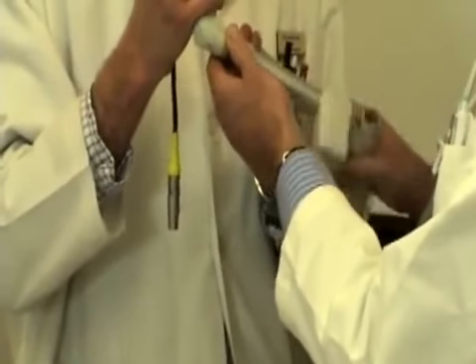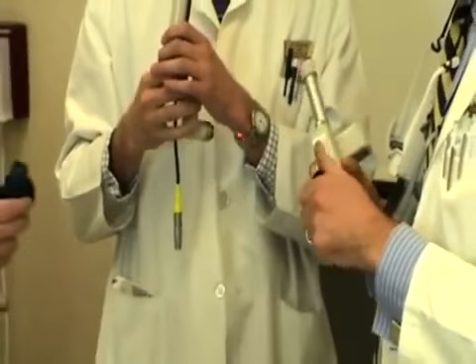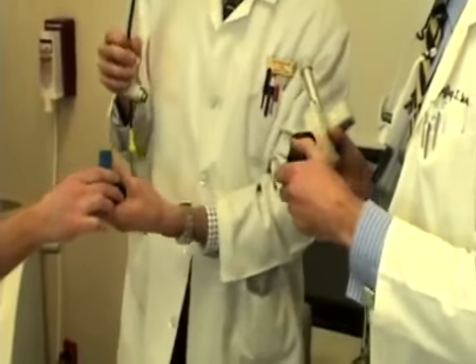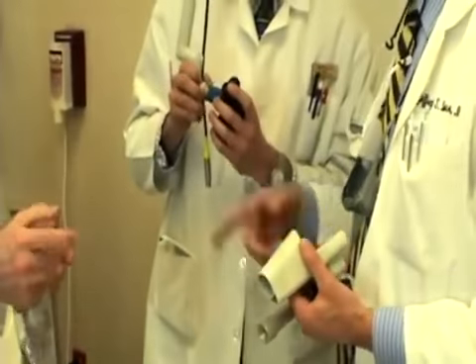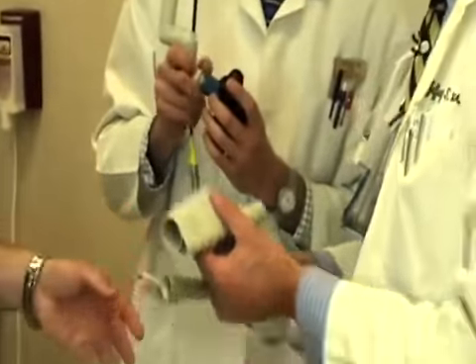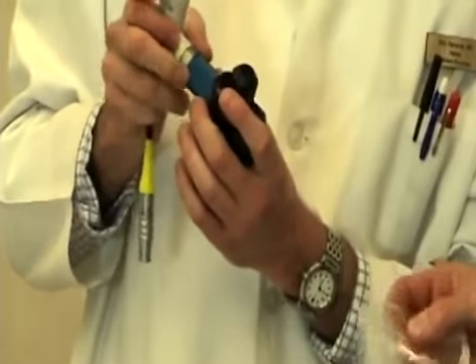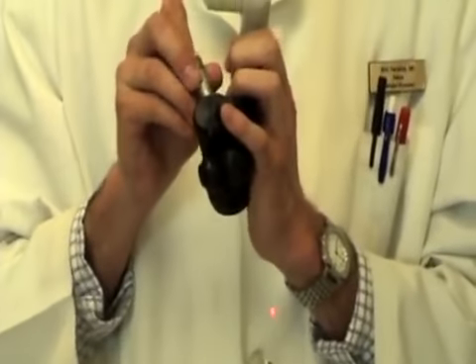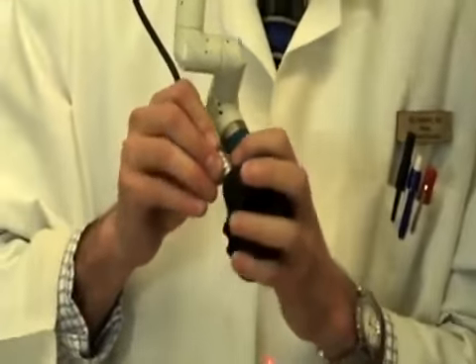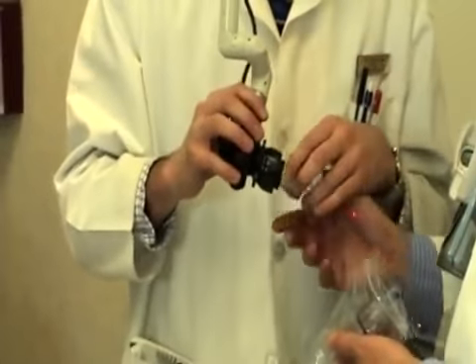With this patient, the decision was made to treat the deeper scars in the central portion of the cheek with the Deep FX handpiece. The Deep FX has a much smaller spot size than the Active FX and allows for deeper penetration. Here, the handpieces are being swapped out and the Active FX is being converted over to the Deep FX. The Deep FX still uses the carbon dioxide wavelength, but with the smaller spot size allows for more concentrated treatment and deeper penetration into the tissue. This allows better, more effective treatment for the deeper scars.